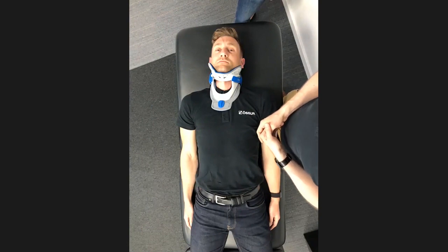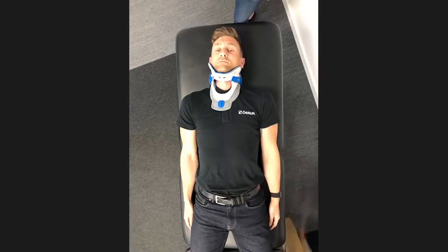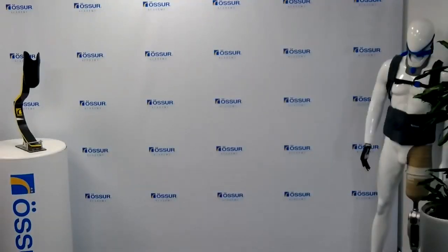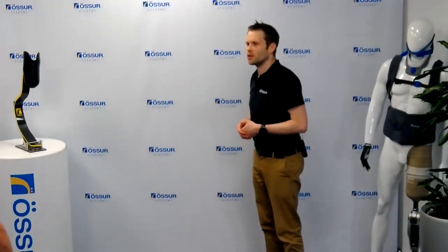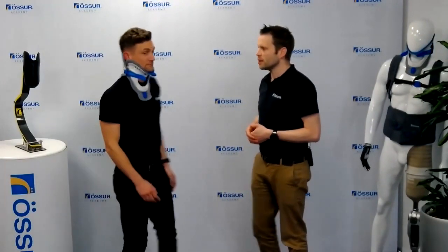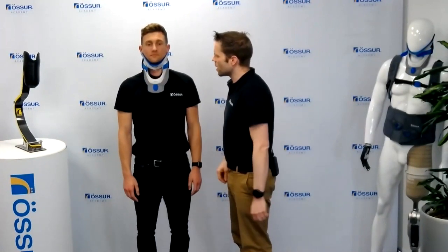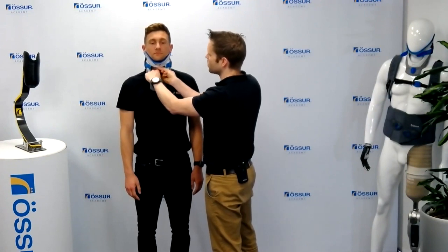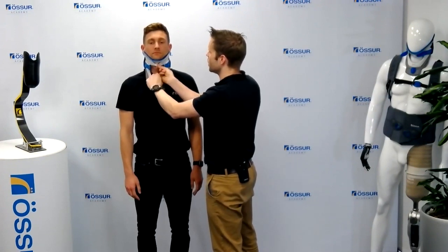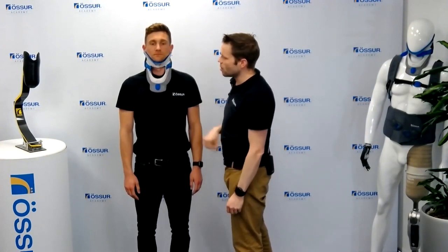Okay, so what I'm going to do is, if we go over to the main camera, I'm just going to have a look at Pete, and we'll just go through the standard fitting just to make sure that this is set up correctly. So looking from the front, you can see that we've got this positioned nice and centrally. I actually think in this case we may just adjust this just a touch. So I'm just going to make a tiny adjustment just to make sure that it's in position on the chin.